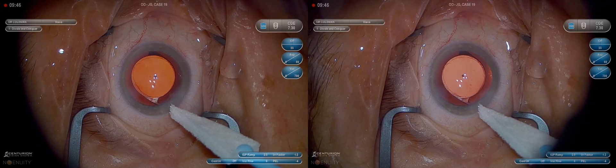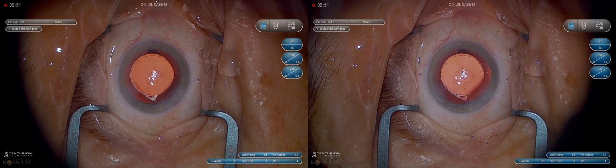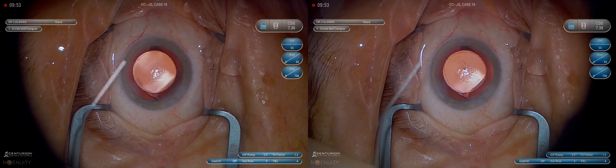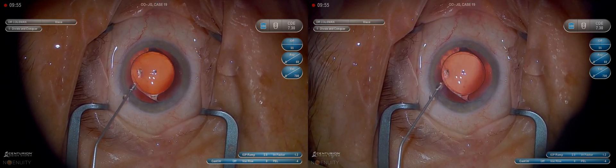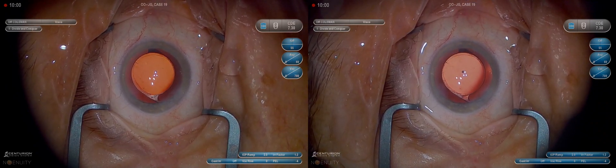Check it with a Wexel. Pressure looks good. Lens looks well-centered. This is intracameral cefuroxime — Vigamox is excellent also. I use it on every case. I hope that helps you guys who are in the early stages of cataract surgery. Thanks.